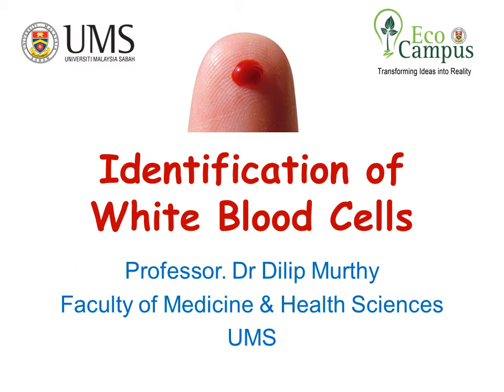Hello, welcome to part 2, identification of white blood cells. Now, in order to start this presentation, we need to refer to the first part, wherein we have developed videos to explain how the blood smear, or the blood film, is going to be made and how it has got to be stained. So with that, we can focus it under the microscope and look at the different types of cells.